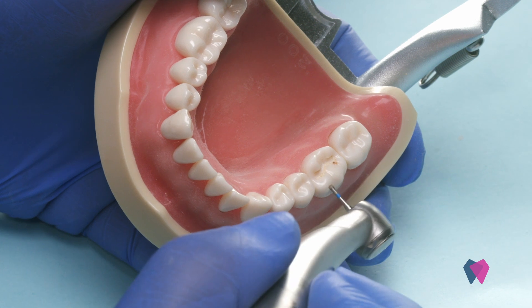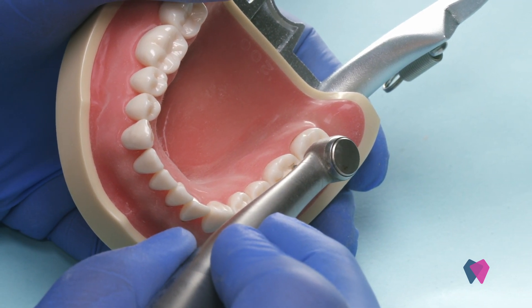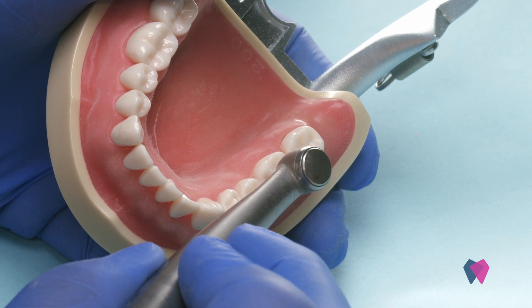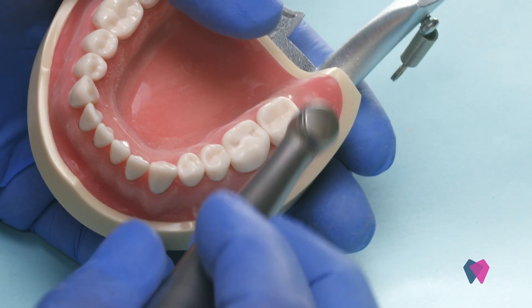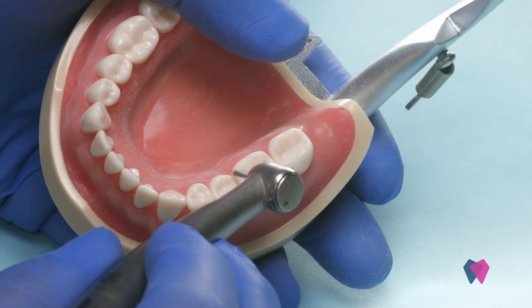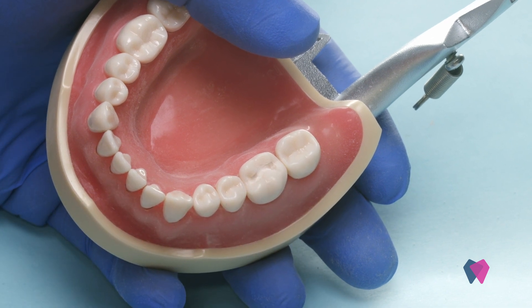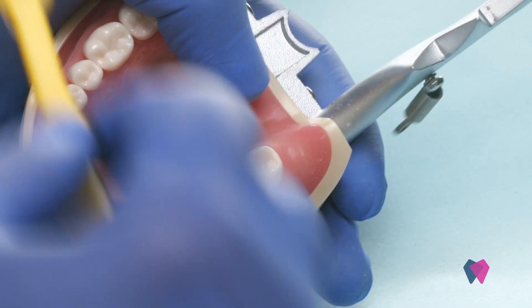You need to make sure that you move into all of the grooves and don't leave any brown discoloration. We particularly like to use a cavity detector — whatever brand you prefer — to put a dye inside the tooth and make sure that all of the decay has been removed before you go to restore your tooth.